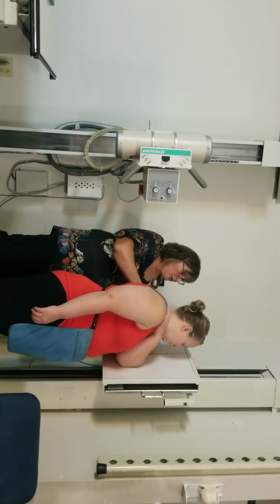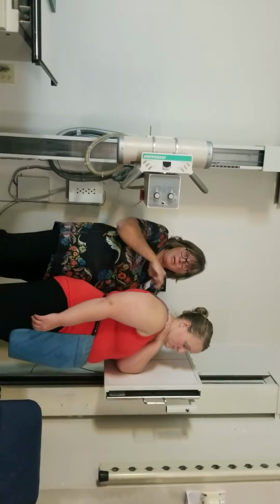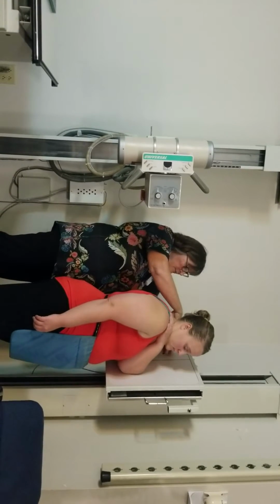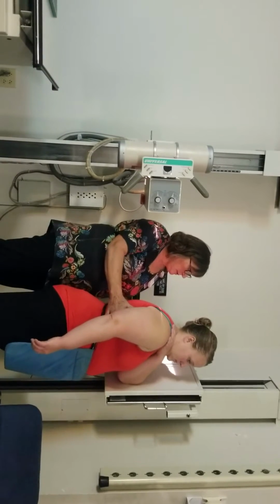We're going to put our shoulder joint right in the middle. What were those two positioning points that we used? AC joint and the scapular spine. Making sure that those are perpendicular. And have you move to your right a little bit. Keep going. Very good.